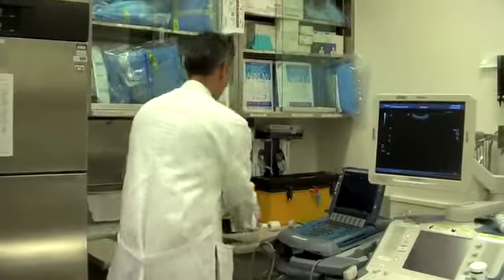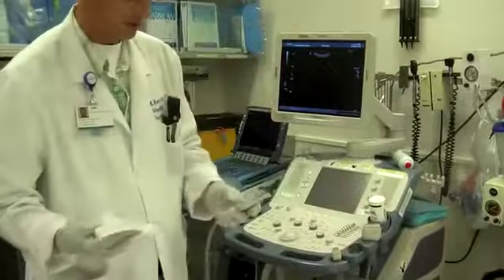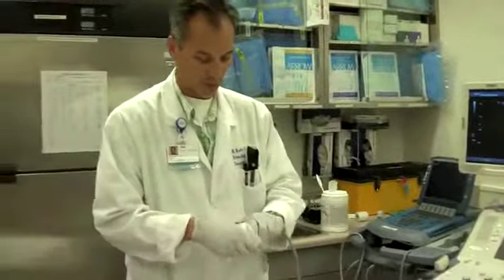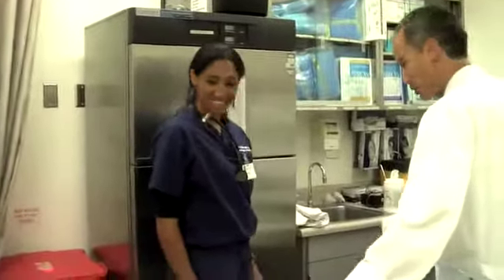When you approach the machine, you take out one of the little cavity wipes. We're just going to clean the probe off. We're just going to get all these little nooks and crannies, sort of like flossing the probe, if you will, but we don't have any floss. We're going to use cavity wipes instead. So we're going to wipe this. Oh, I need the vaginal probe. Okay. So which one? Is it this one?